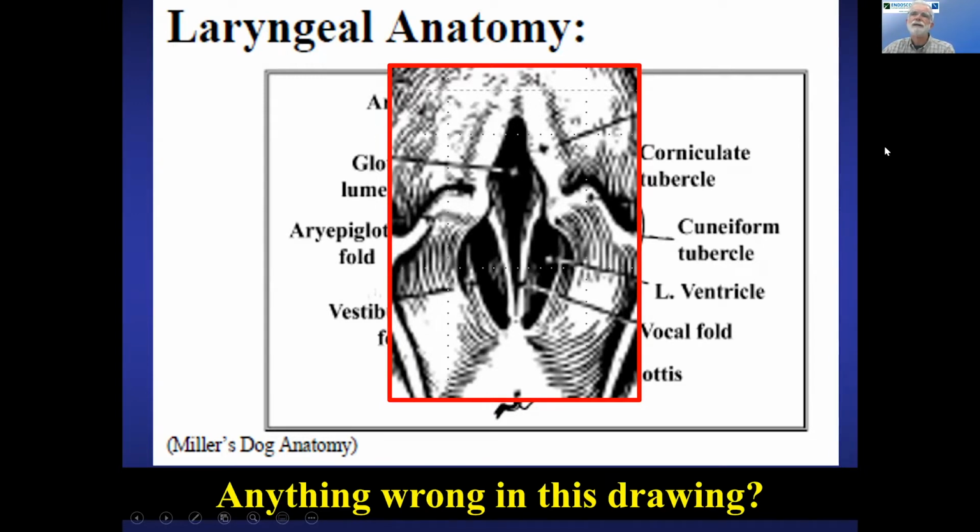If I look carefully at that, and this is only the first time, you know, you look at something over and over, and this is the first time I really said, wait a sec, that's not right. Because that vocal cord curves upward. Vocal cords should be a straight line, taut. And we'll come back and see some examples of normals and abnormals. But that's what I saw abnormal in this case.